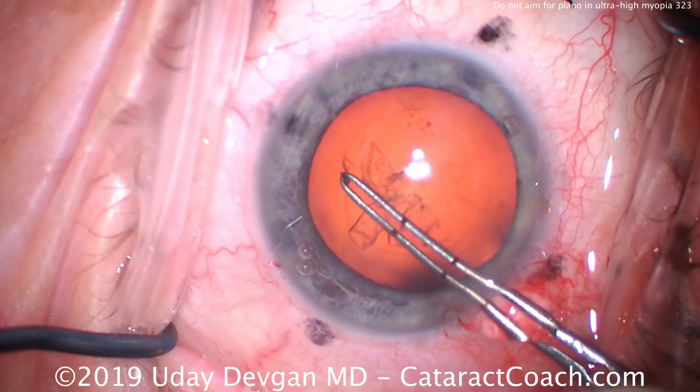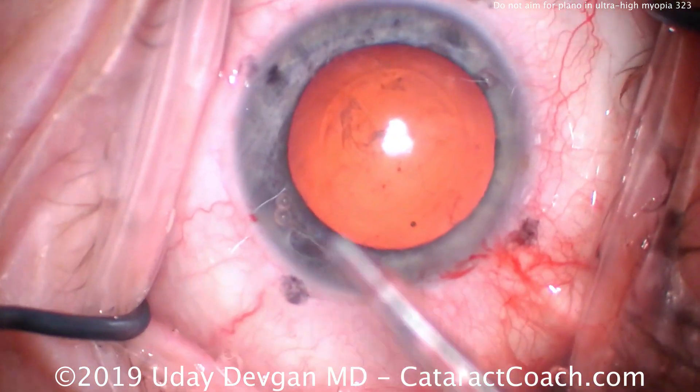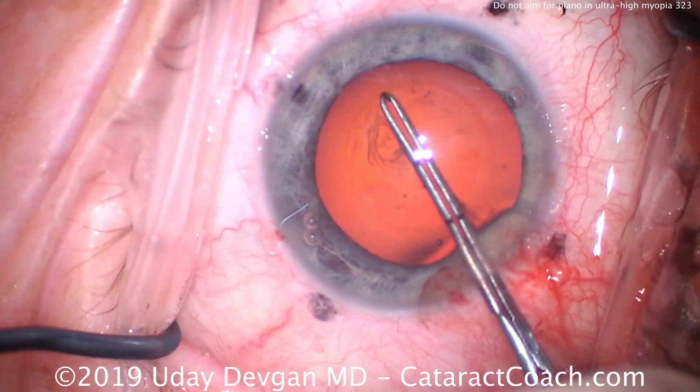You can see with the marks on my forceps, these are just about perfectly round and at 5 millimeters — exactly 5 millimeters. That's what we want.